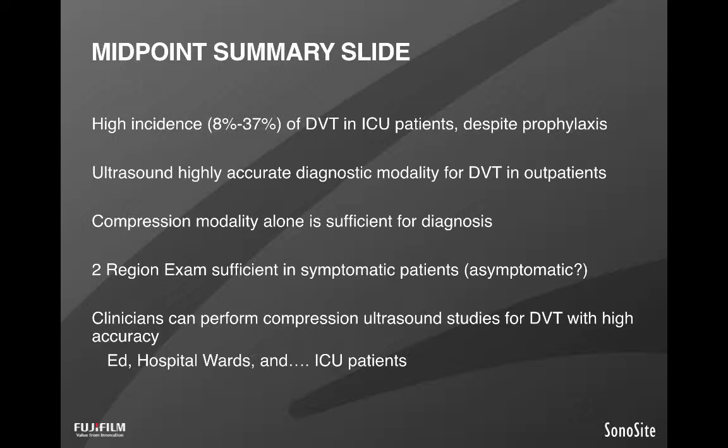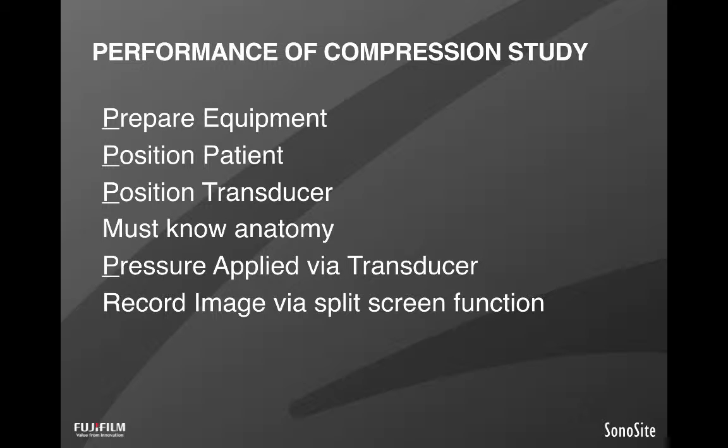And that can occur in a number of locales, not only emergency medicine, but the hospital, as well as the ICU. So let's change gears, and let's get down to the nitty-gritty, as we say, and talk about how to perform a compression study.